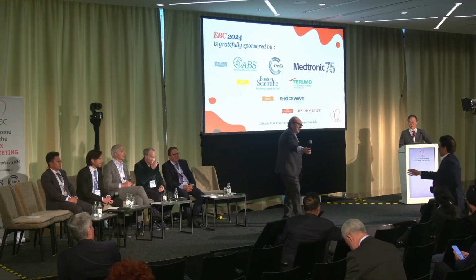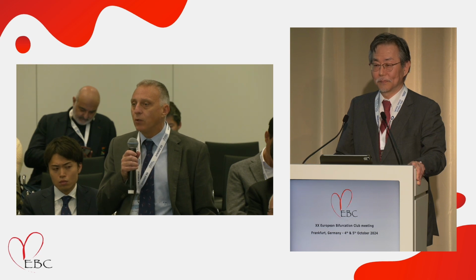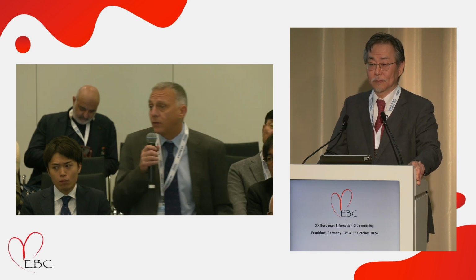In the meantime, I have a comment, Professor Murasato. Before discarding the value of drug-eluting stent in Medina 001, don't you think that we should check if the technique for implantation was appropriate? I mean, POT done not systematically. How is it possible to implant stent in Medina 001 not performing POT when we know that it is really the condition where there will be the measure mismatch between the two sizes? Did you analyze in this direction?